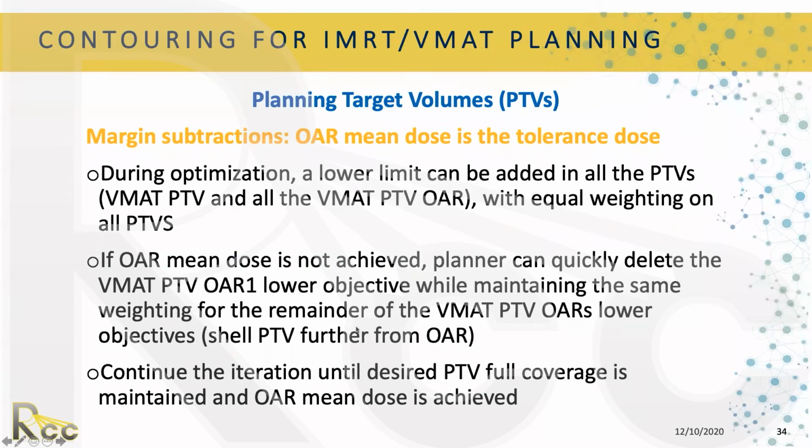And then during the optimization, you're going to start putting a lower limit on the VMAT PTV and all the VMAT PTV ORs with equal weighting. Then you're going to start watching.